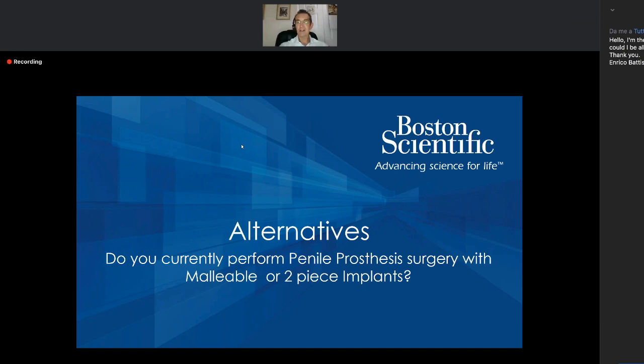I know we've heard from all of our faculty on this already, and I know, Salah, you provide all of them, and indeed your market is very dominant with malleable implants. Enrique, have you got much experience with two-piece implants at all? I have implanted and I like it, but I mean, you have to select the patient very carefully.